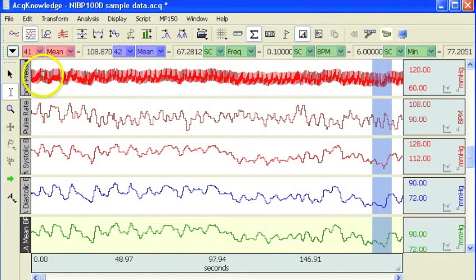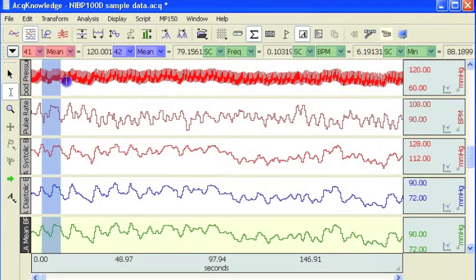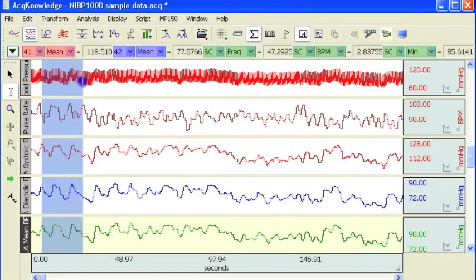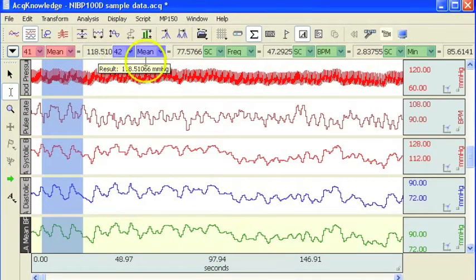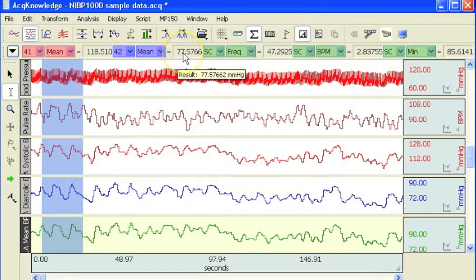In this case, quite often, you're going to take different measurements from different channels. You come in, you highlight an area of data and the measurement results are updated and you can paste those down into the journal file or into Excel.